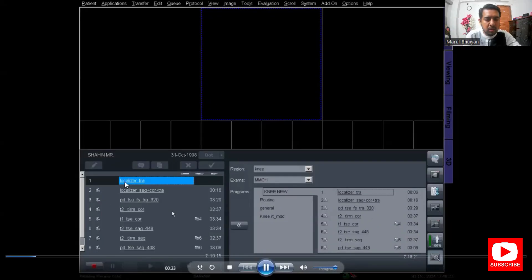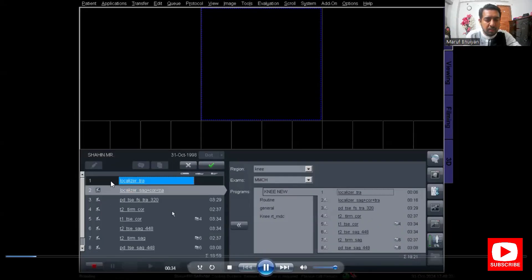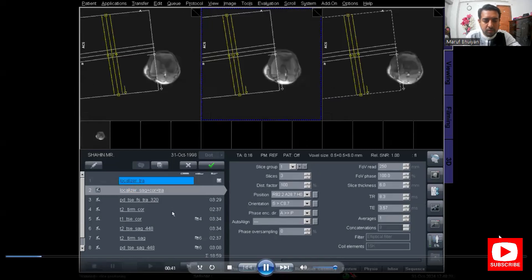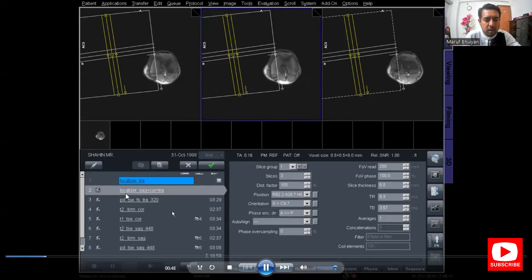Now the first localizer is running and scanning. The localizer axial image is shown on the window. We will now plan the second localizer for sagittal, coronal, and axial.